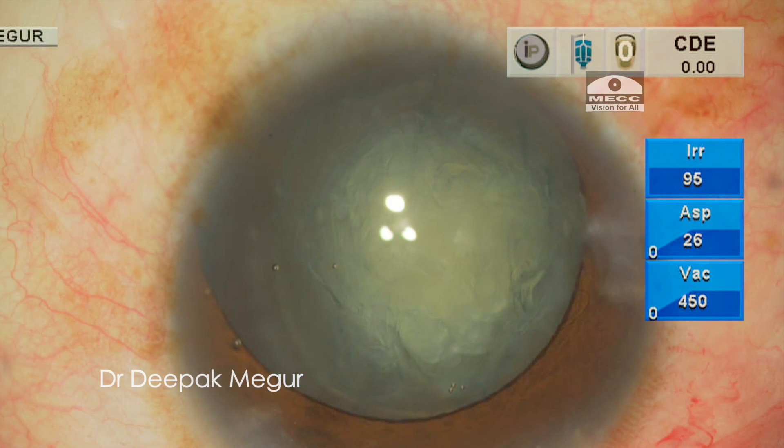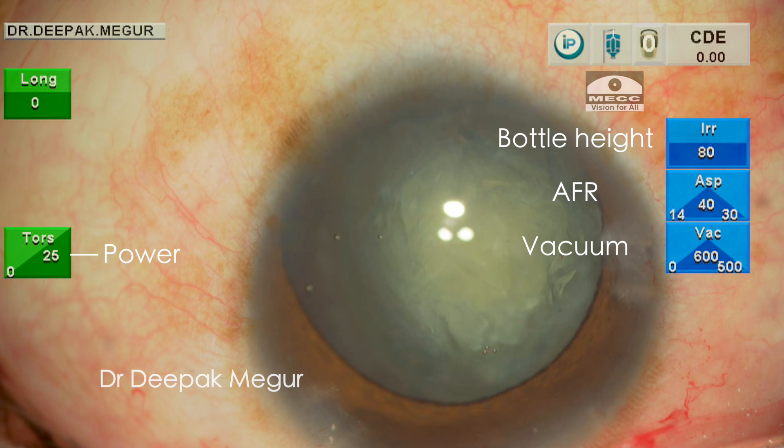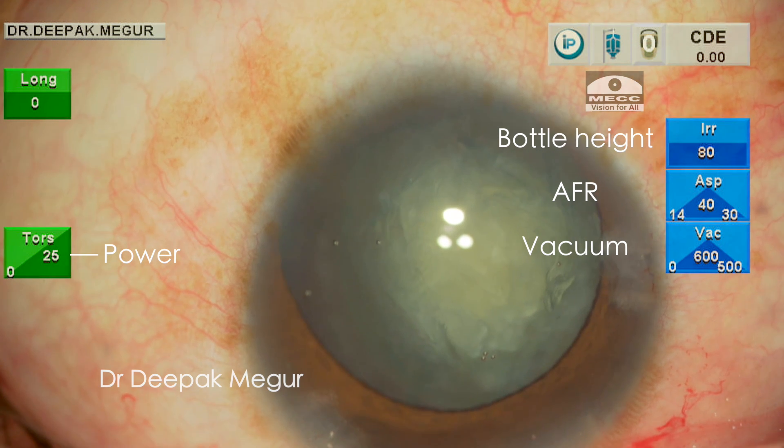At this point I have decided to postpone my insertion of CTR, and since the bag looks reasonably stable I plan to insert it at a later stage. I proceed to emulsify the nucleus now.